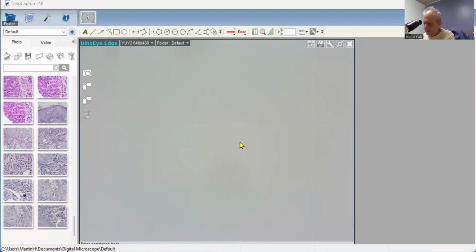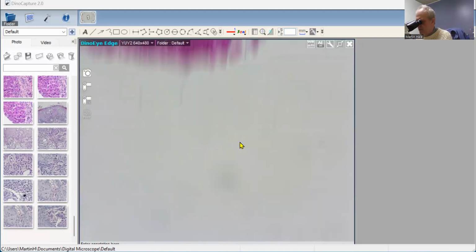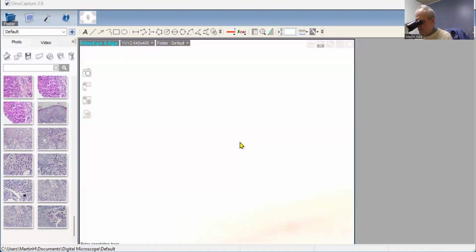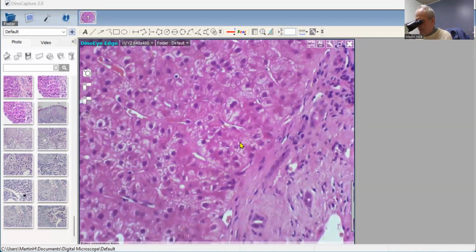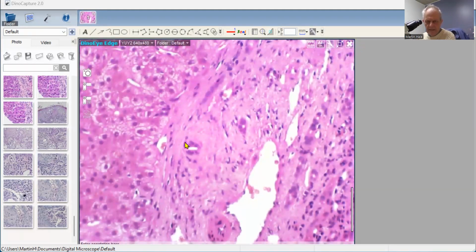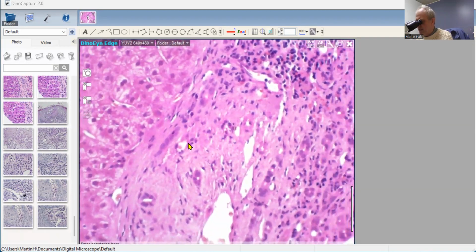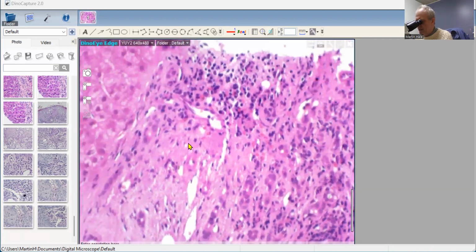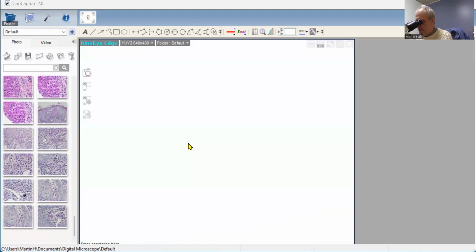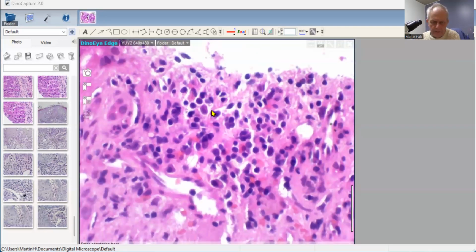So now, when we look at the cellular infiltrate, if we, for example, look at this area here, we can see that we've got hepatic arteriole, the vein, portal vein, bile ducts there. And what we're interested in is the cellular infiltrate. When we look at it, we can see that there are, once again, significant numbers of plasma cells.